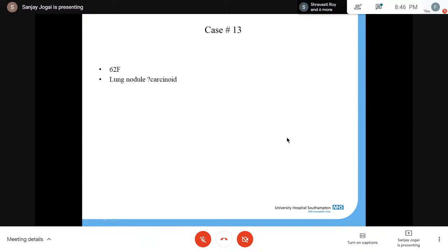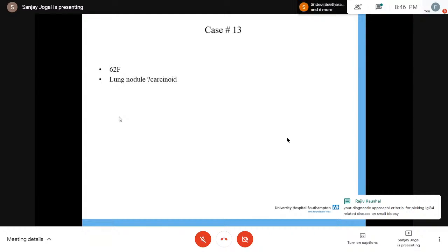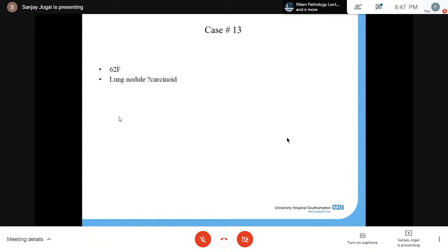No, go ahead. There's a comment on the YouTube by Dr. NP. He says napsin A does not add significantly to the workup of cases, especially if you use a panel of markers and have clinical findings. Yeah, I would agree with that. Yeah, it is almost exactly the same line as you say.